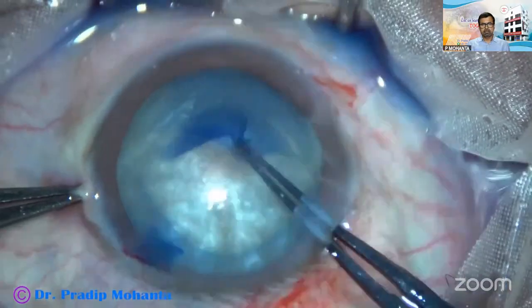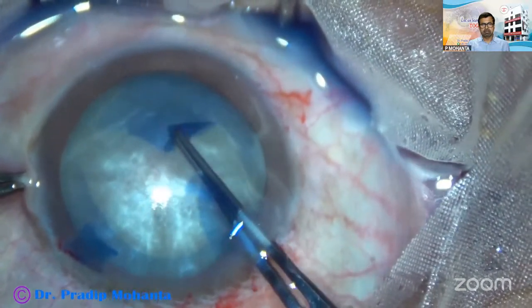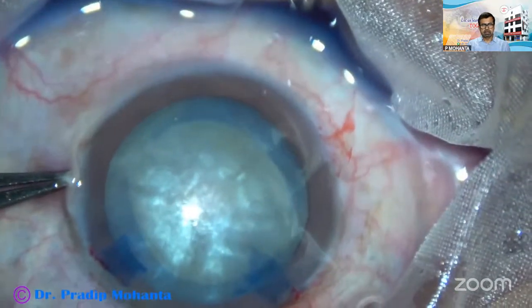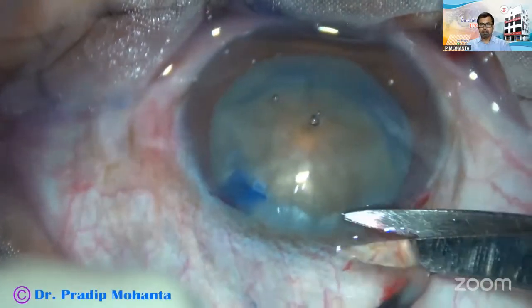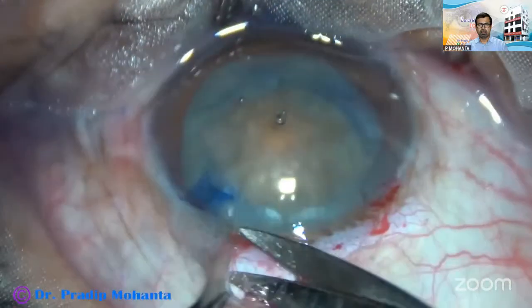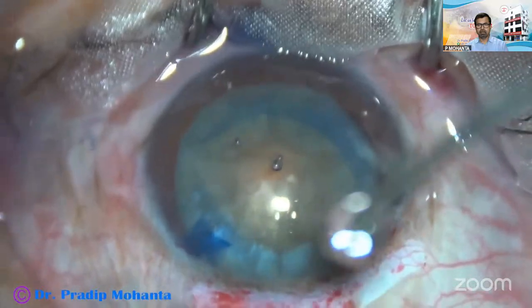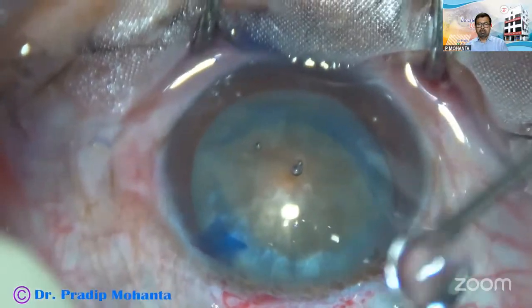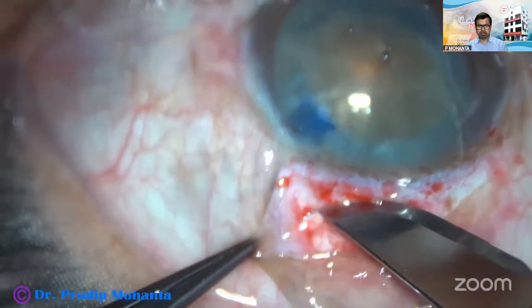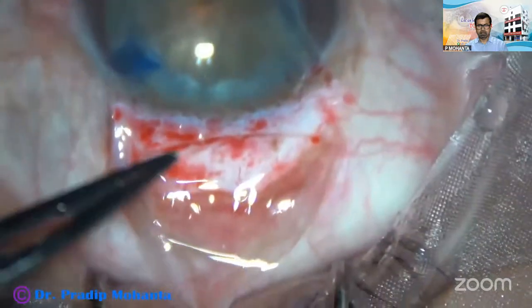One of those can extend posteriorly and there can be vitreous prolapse and lot of other complications. So the right choice is to convert to SICS. Peritomy is done between the two incisions, the main incision and the side port. The cataract is grade 3 plus, so at least 6 mm incision is made, a mild frown incision.